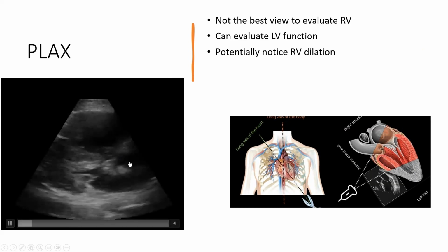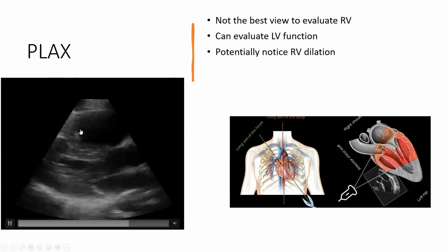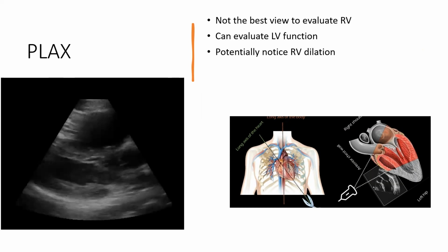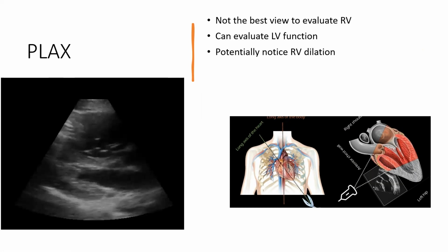This is not 1 to 1 to 1. This is dominant. This takes up about half of our field of view. So far, based on our parasternal long axis view, this patient who showed up with hypoxia and dyspnea and no obvious lung pathology for her symptoms has a dilated right ventricle. That's a pretty good quality image.